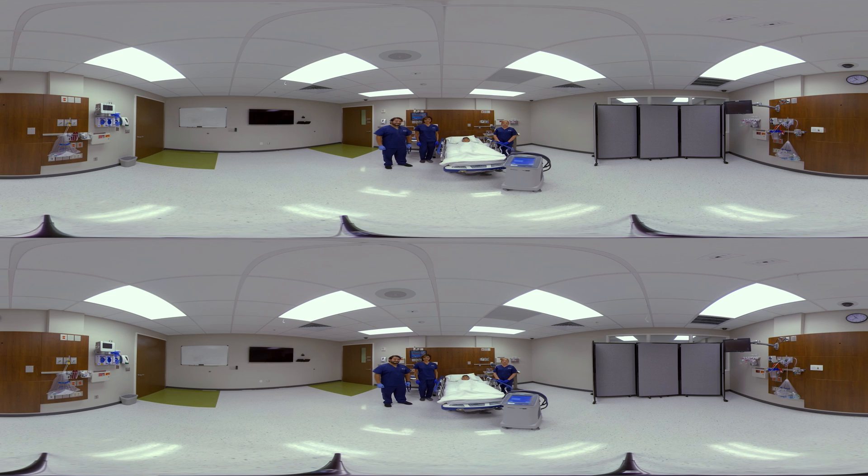Next, we're going to demonstrate how to use a set of four Arctic gel pads. In the pediatric ICU, you can use neonatal, small universal, extra extra small, all the way up to large, depending on the size of your patient. Once we choose the extra extra small pads, it's a set of four that come in a package. When we open the gel pads, we're going to have two torso pads and two thigh pads.